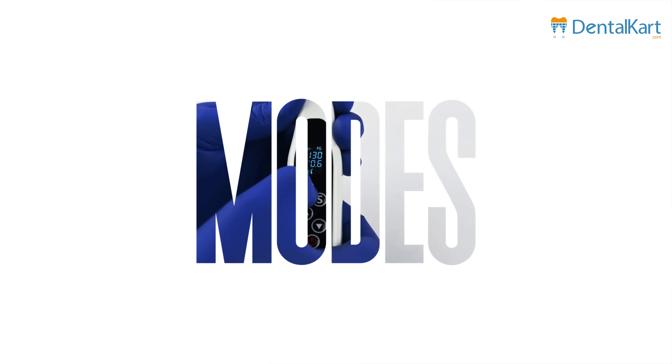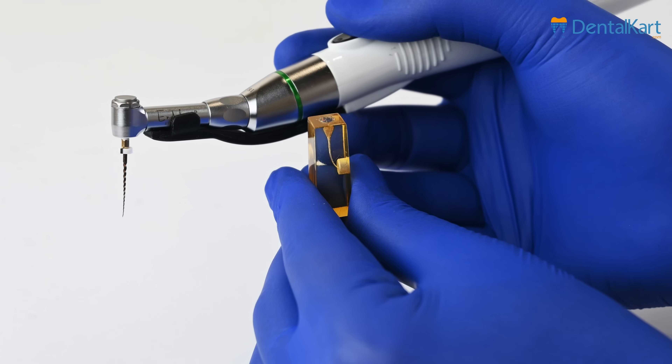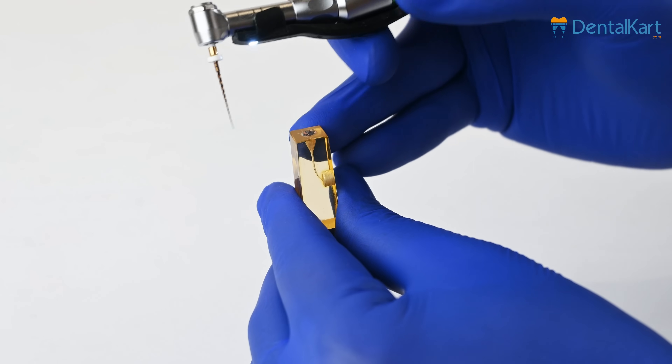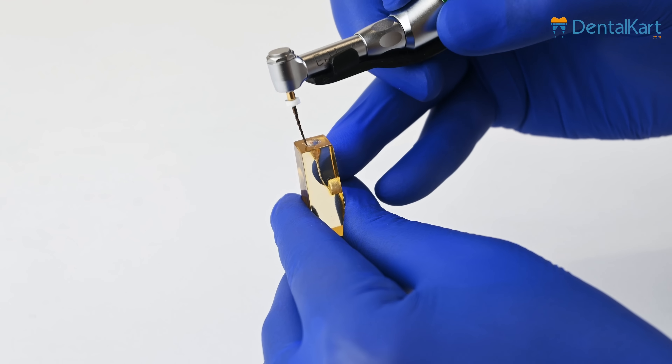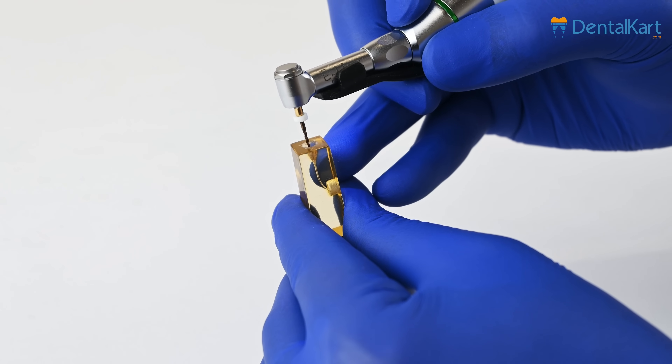The Endoking Endomotor offers a range of modes. Auto, Reverse and Stop: this mode starts with a clockwise 360-degree rotation and automatically reverses if the preset torque value is exceeded, providing added safety during procedures.